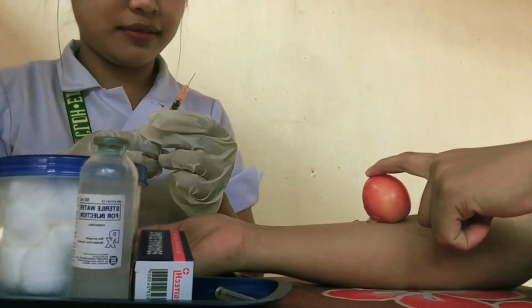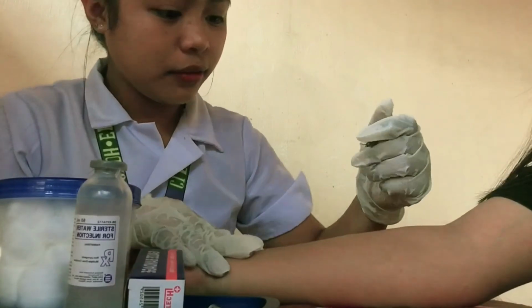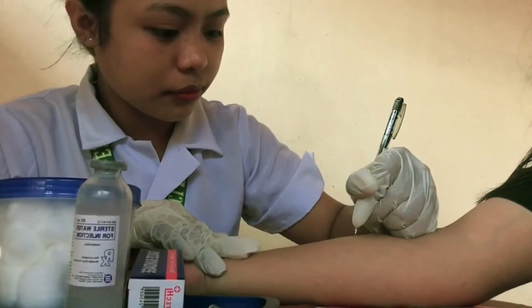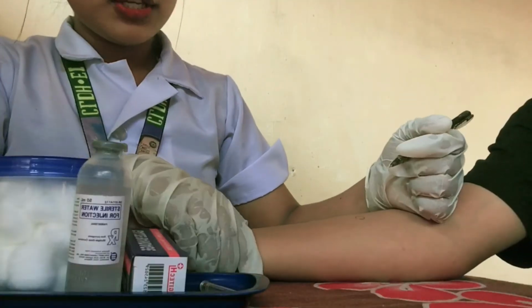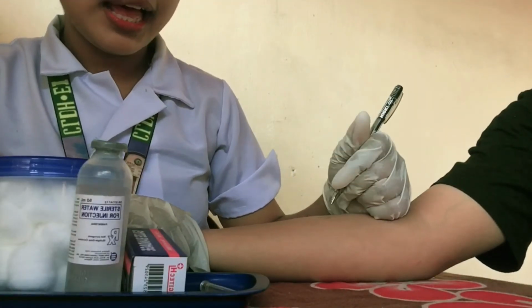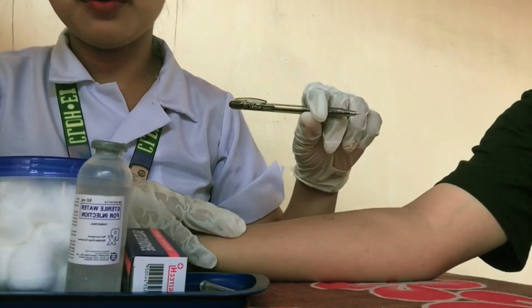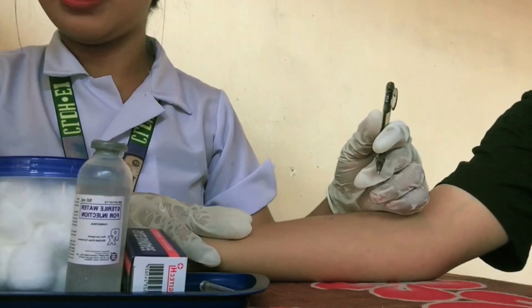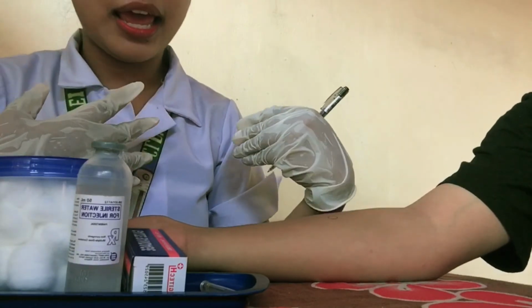After I do that procedure, let's assume that I created a wheel. So we need to encircle the wheel with blue or black ink, and now we need to write the time that we injected.